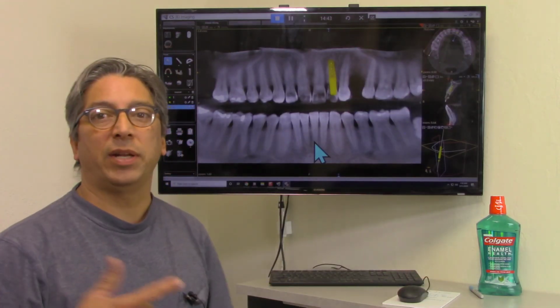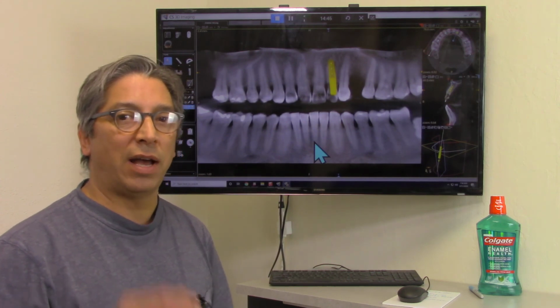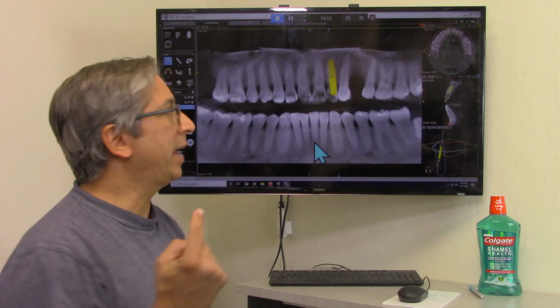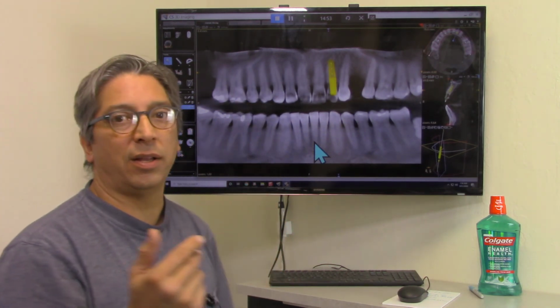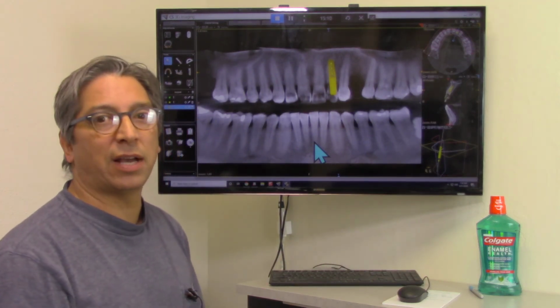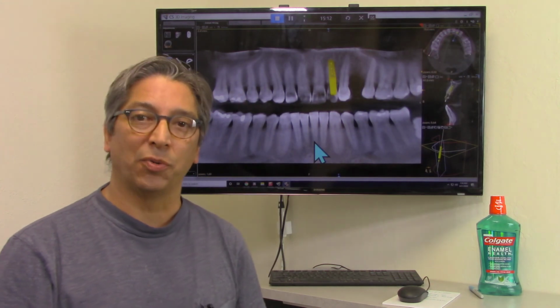If somebody is a dentist and is looking at this case, I would say this is actually a good case to try an immediate placement in an anterior zone. You have a very low lip line, so you don't have cosmetic concerns, and you have a very good immediate placement stability, and you have a very thick top or gingival third of bone that's going to hold that space there. So if I were going to tell you, I would say you might want to tackle this one as a first immediate cosmetic case to do, not an 8 or 9.